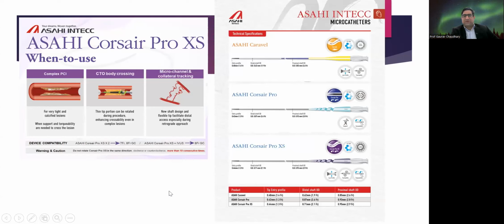So it is one of the most commonly used microcatheters nowadays, and there is a bit of difference among these. I should say this has the smallest tip profile, that is 1.3 French, although the proximal segment has a profile of 2.9 French, but the distal tip is 1.3 French, and it is different from Corsair Pro. Corsair Pro XS has a distal shaft profile of 2.1 as compared to the 2.6 French in case of Corsair Pro. So it is more of a tapering, and it can be very well negotiated across a septal collateral. It acts also like a channel dilator.